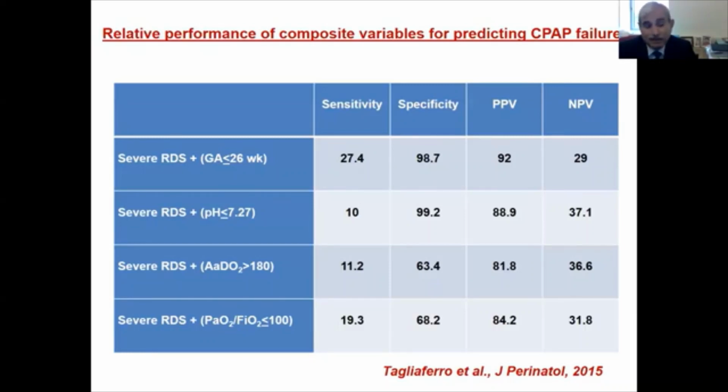Whether you can achieve that with a nasopharyngeal tube, we haven't looked at it. The reason I mentioned that is we have a setup right in the delivery room, so we start CPAP within 3 to 5 minutes of birth. And I can share with you how we transport babies from that area. We transport babies on blended oxygen. Most of our babies, you won't believe, and this is true for other places too, and perhaps this is the experience at your end too, are in room air, whether you're ventilating or on CPAP.